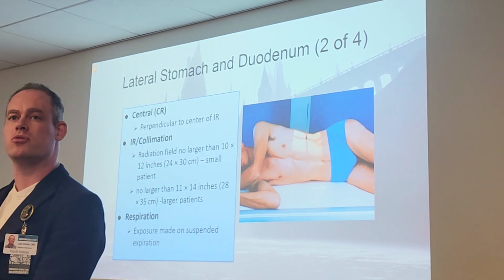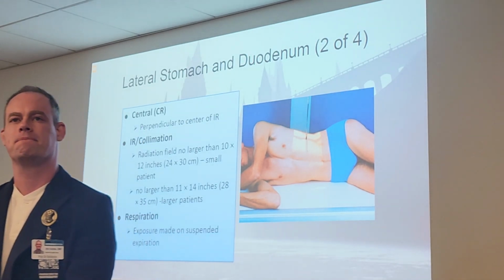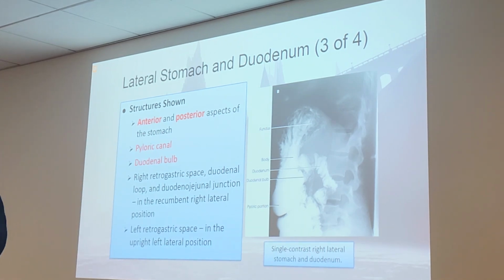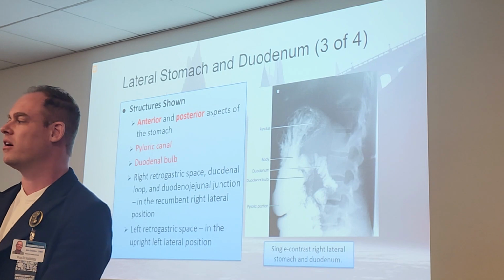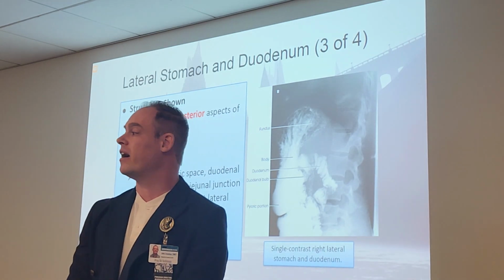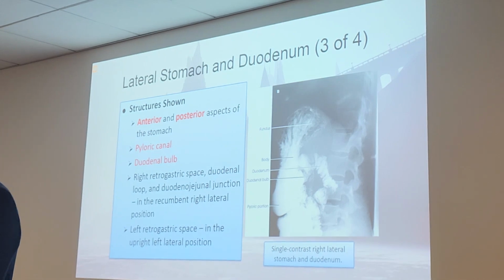Okay, it's perpendicular central ray. We're still suspending on expiration. That's the same. No change there. What are we looking at on this one? This one is primarily for the anterior and posterior aspects of the stomach. That's why we do a lateral stomach and duodenum. We also are going to see the pyloric canal and duodenal bulb in profile again, just like that RPO. So this was just that pyloric canal in the best view.